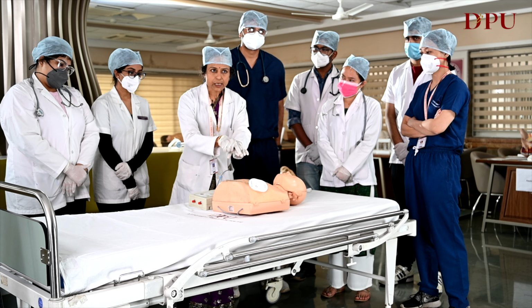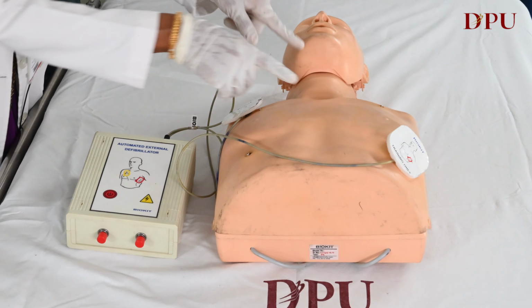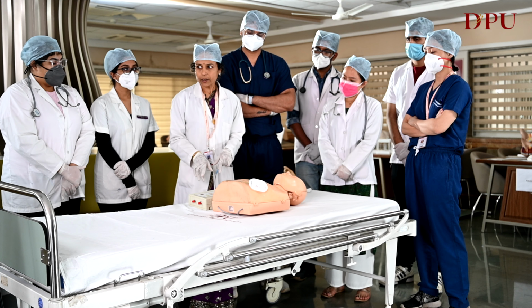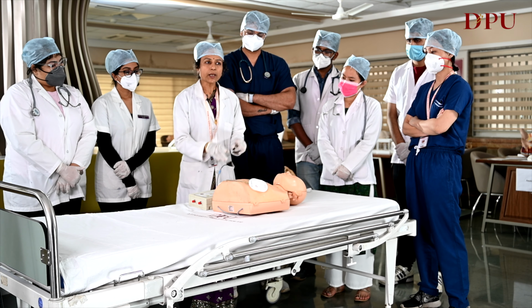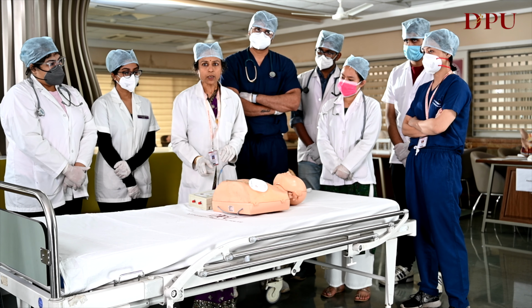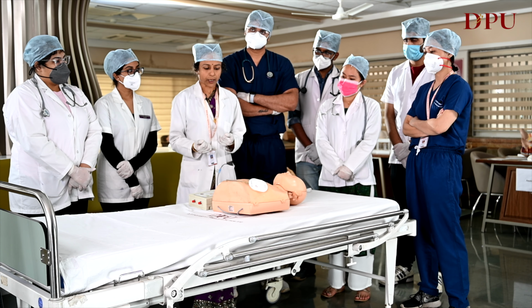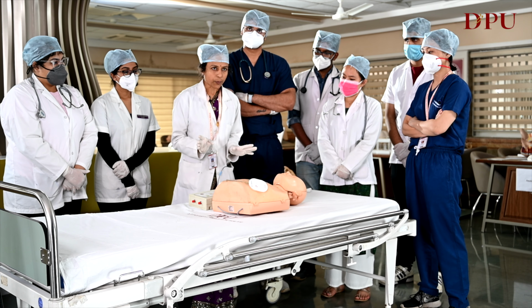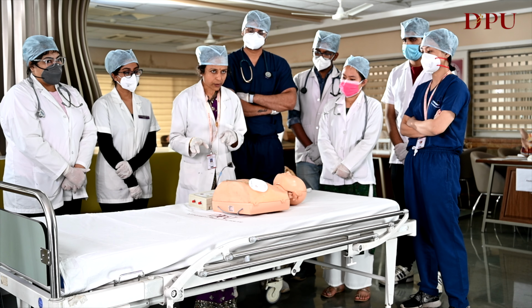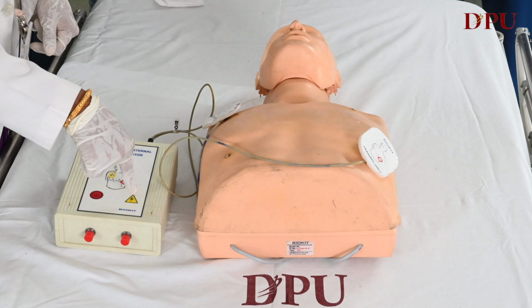Then whatever chest compressions are going on, you stop temporarily and allow the machine to analyze the rhythm. It has microprocessors inbuilt, so it will analyze whether it is shockable or not. If the rhythm is shockable, the machine will talk to you. That is, the AED gives an auditory prompt that rhythm is shockable, shock advised. Then you just press the shock button.